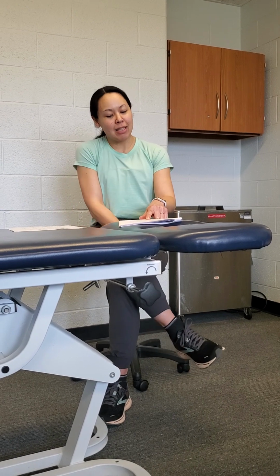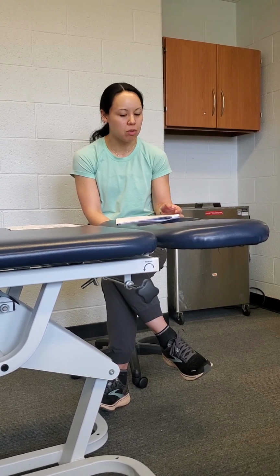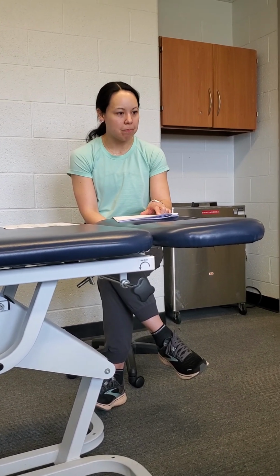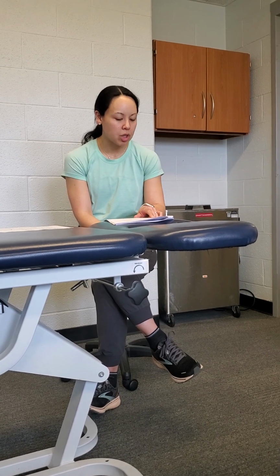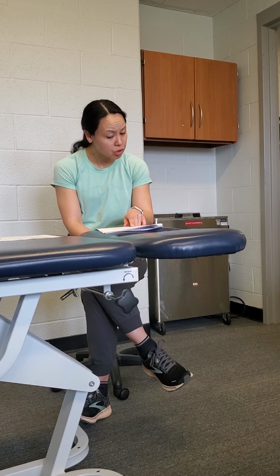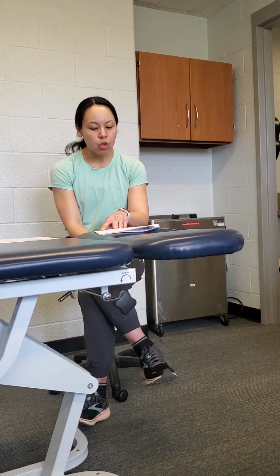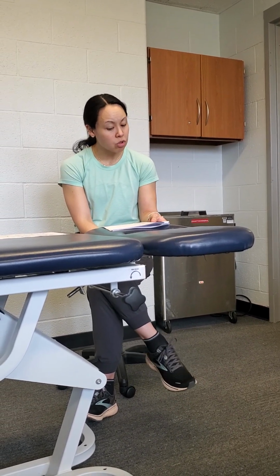And this is probably not going to be realistic for us, but the goal is to do it 1 to 2 times per day. So it's like as many times as you can, essentially, with those post-op patients, or the patients coming in post-injury. You can place the tourniquet on the non-surgical limb, or the non-injured limb for a crossover effect, just like we would do with some of our strengthening in general, if it's too painful for the patient to have it on the surgical limb.